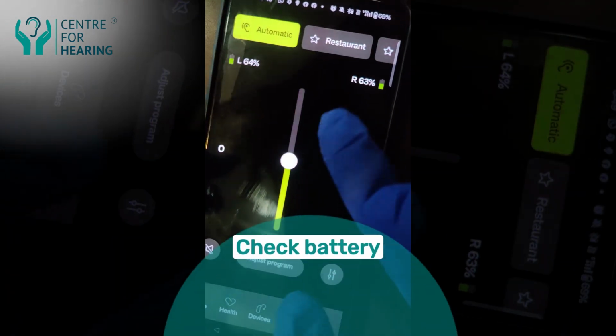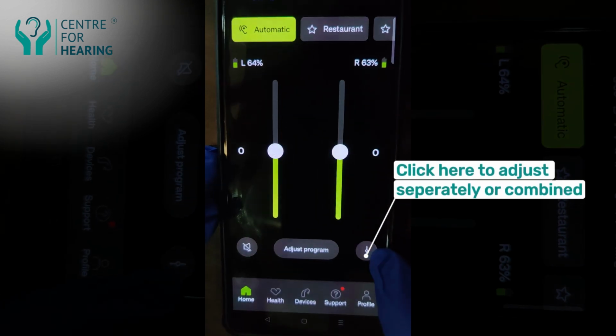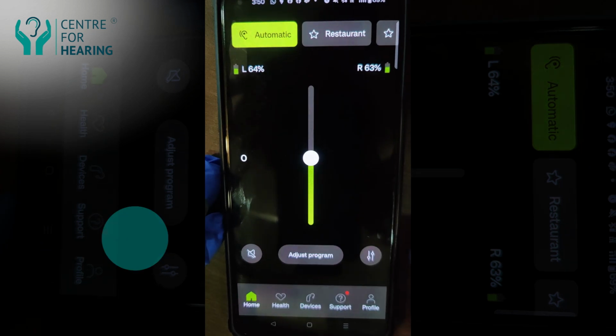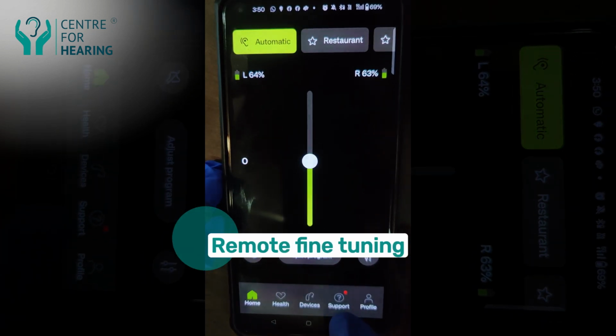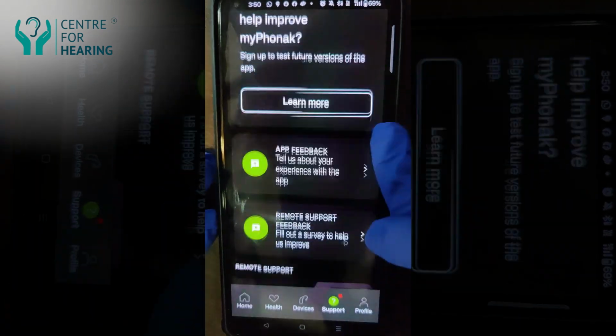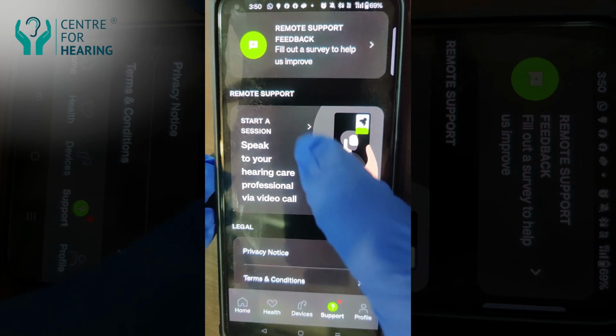So you can check battery using this and you can do minor adjustment. By clicking here, you can do it separately. With this application, we can even do remote fine tuning. So here, if you go to the support option and scroll down, you will get an option, start a session. It's a very useful feature in this application.